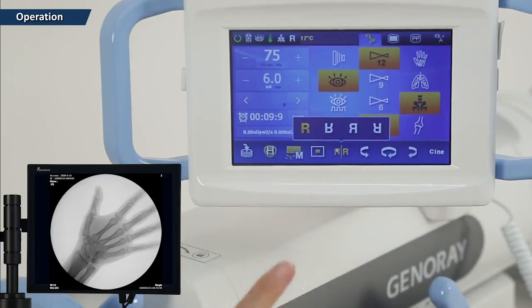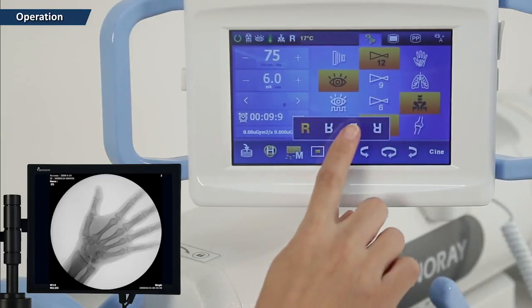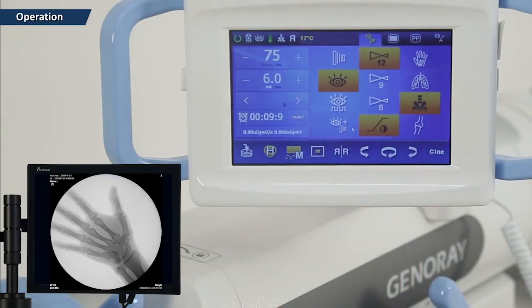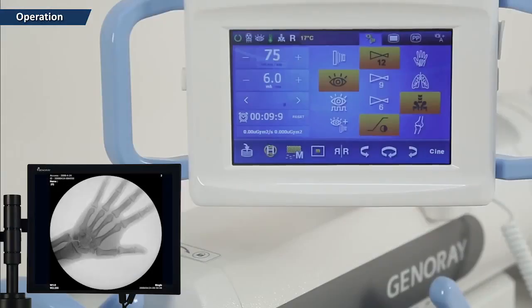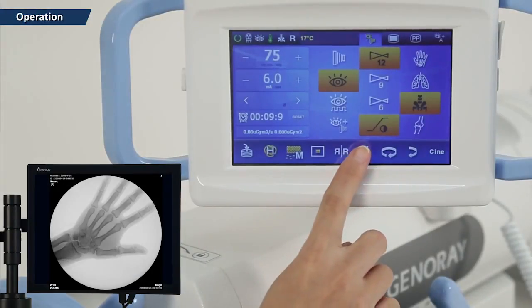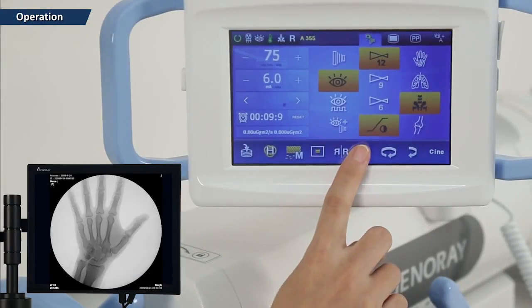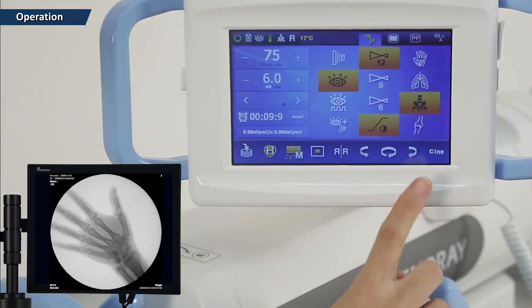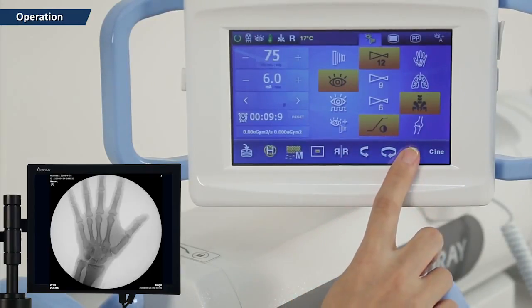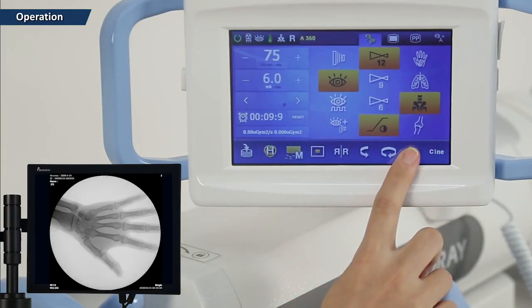The image reversing button — use according to appropriate circumstances. The image rotation button — use according to appropriate circumstances. Pressing the initializing button returns it to its initial state.